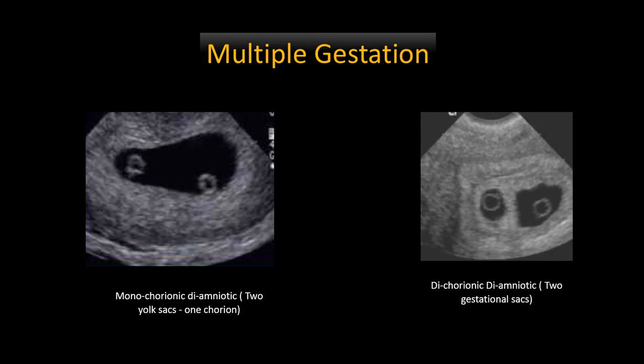Once the diagnosis of intrauterine pregnancy is established, it is essential to scan the entire pelvis to document the number of embryos. If there is multiple gestation, it is important to determine chorionicity as early as possible. The chorion forms a thick echogenic ring that completely encompasses the embryo. If more than one embryo is seen within a single chorionic ring, the pregnancy is monochorionic. The next step is to determine amnionicity. The amnion is a very delicate membrane that may not be seen in early gestation; however, the number of yolk sacs parallels the number of amnions. Therefore, if there are two embryos and two yolk sacs, it is highly likely that the pregnancy is a monochorionic diamniotic twin gestation.